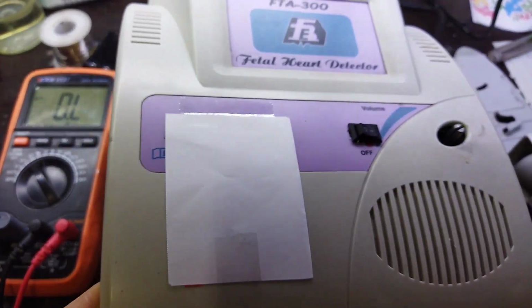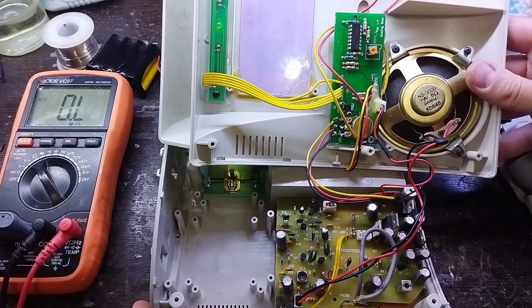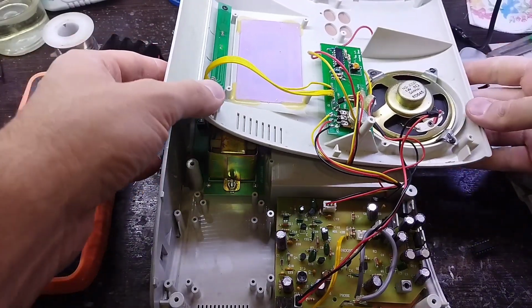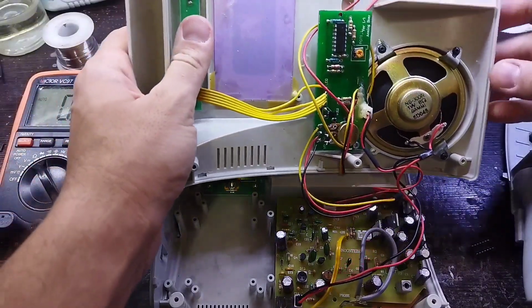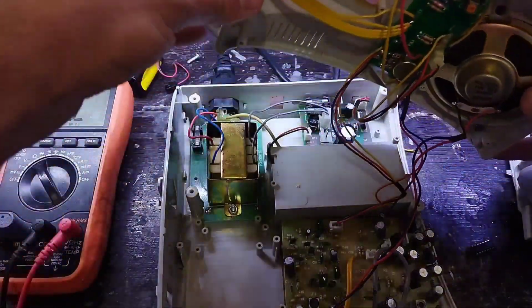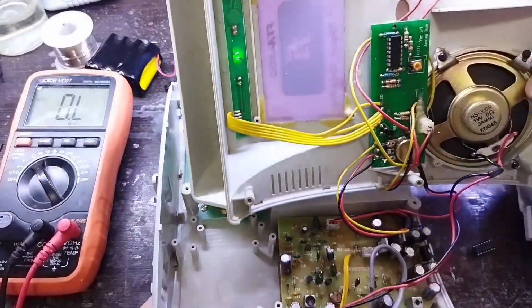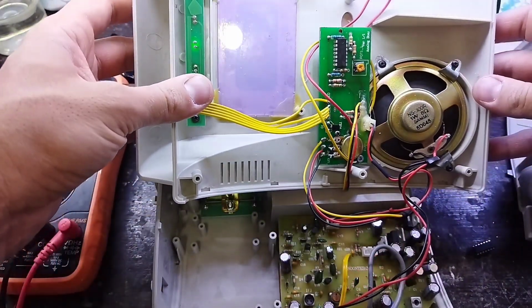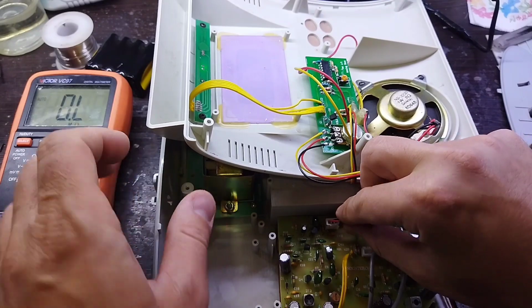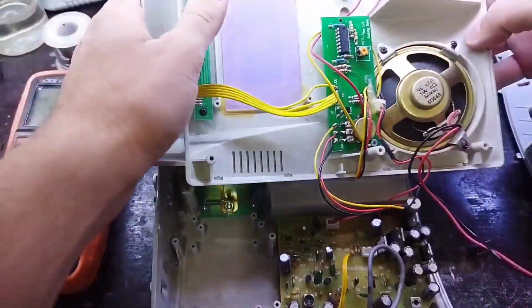This device is one of the fetal heart sound detection devices, the problem of which was the lack of sound production. Through my investigations, I found out that there is a problem in the sound amplification IC, and I also tested the probe of the device and made sure of its health. This device has a very sensitive yet powerful microphone. The device uses this microphone to listen to the heartbeat of the fetus. The processor of the device also processes the sound captured by the microphone. In this way, the fetal heartbeat can be heard through a speaker.